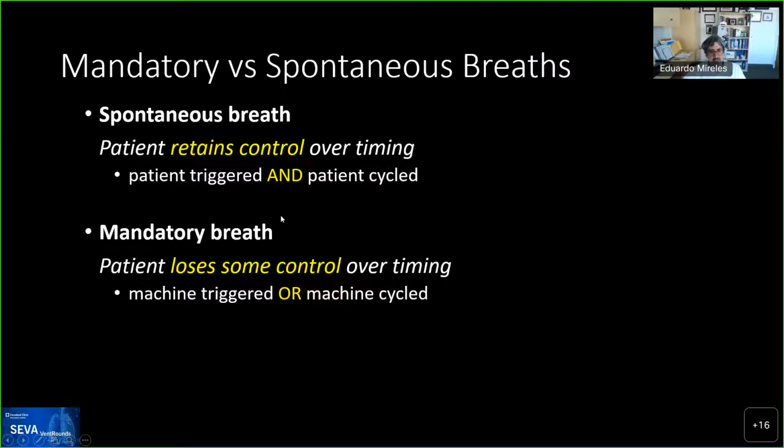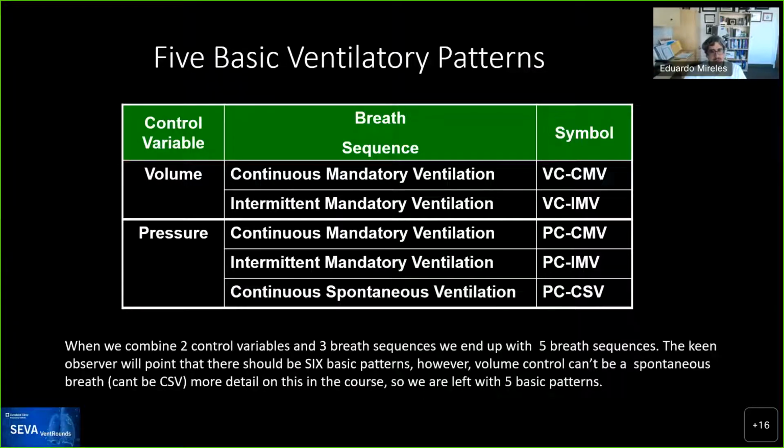And so with that, we come to the last part of the tag, which is essentially the targeting scheme. And the targeting scheme is simply the way that the ventilator controls the interaction with the patient. And it gives a specific ventilatory pattern. These became more complex and with more variations once we had the ability to put computers on the ventilator.